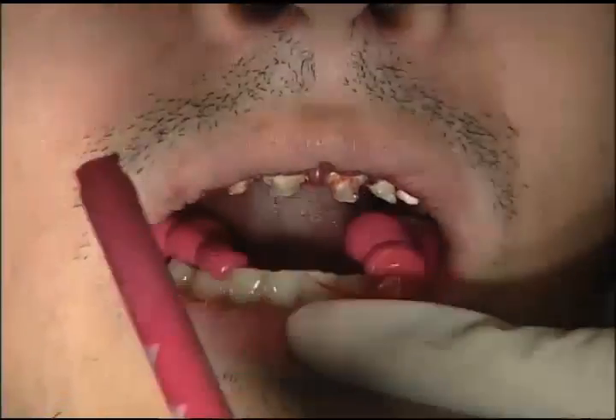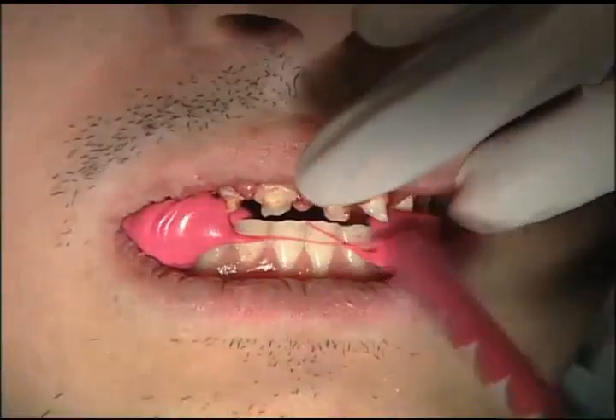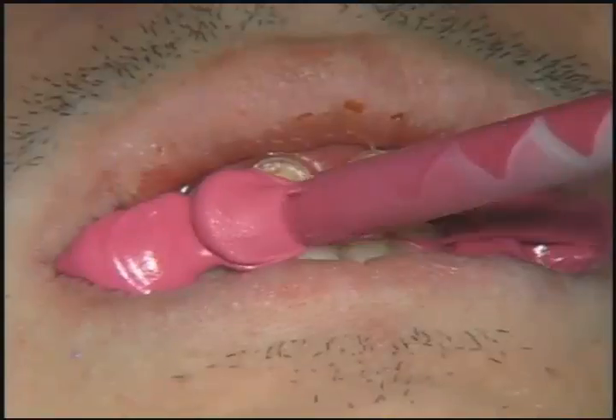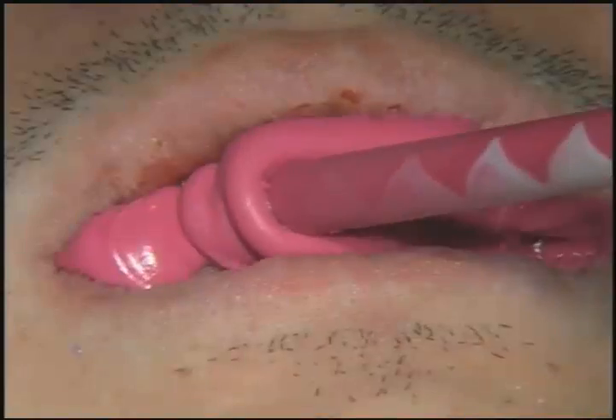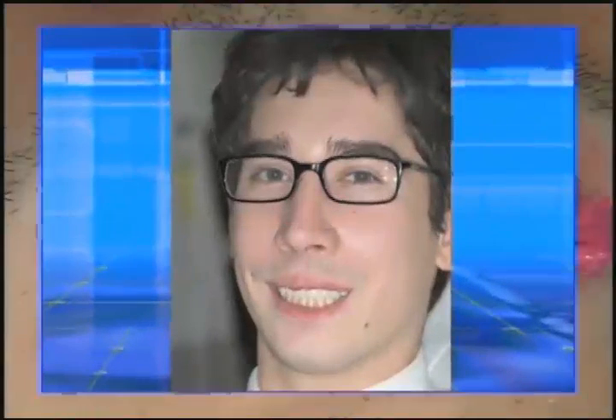Because we haven't prepared the second molars of the maxillary arch, we can take the bite registration without having a jig or the temporaries in place. We express it all the way around the arch except for the second molars and have the patient confirm that he's in maximum intercuspation. At the end of this appointment, you can see with the biotemps in place and a very numb upper lip, we still have some nice aesthetics. Once the bite registration is set, we trim it with a scalpel so that the only indentations are where it's contacting the incisal or occlusal third of the prepped teeth and the incisal or occlusal third of the opposing teeth. The bite registration should not contact any soft tissue — that will cause it to be inaccurate.